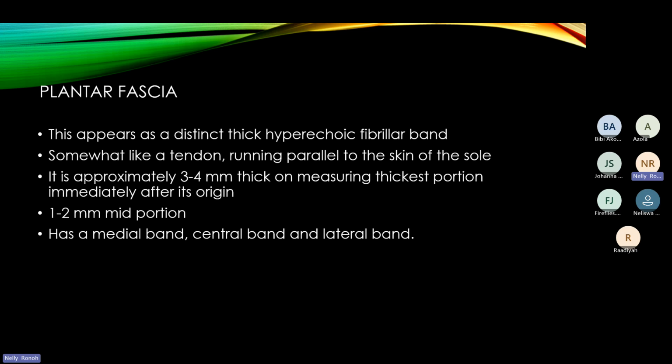But if you choose to scan further down to its mid portion, then it should be 1 to 2 millimeters. It should actually be reducing.